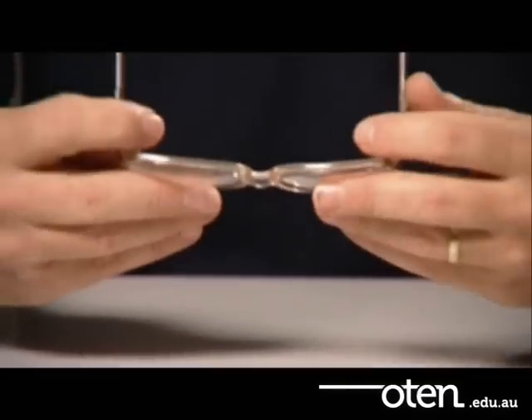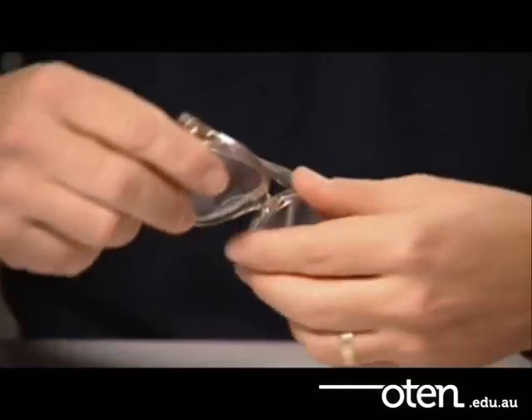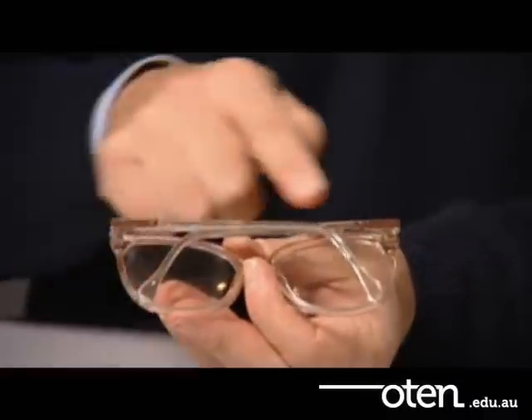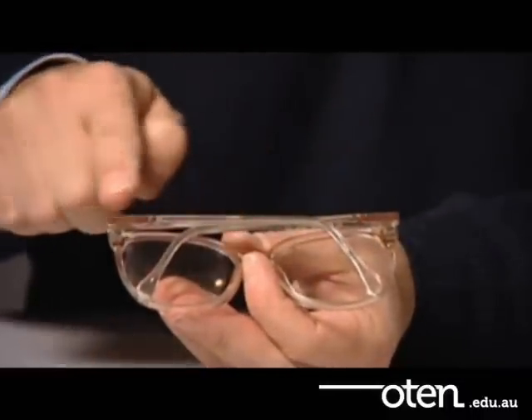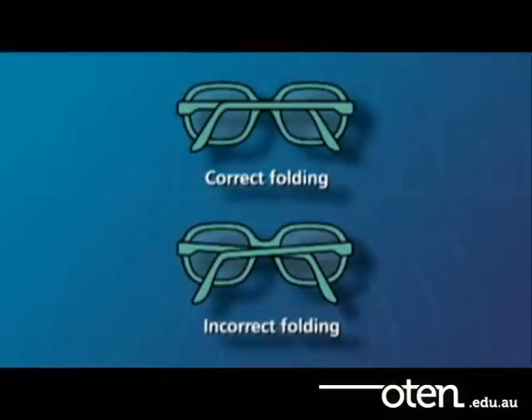When closed, the temples should fold so that they are parallel to one another or form slight angles. These angles should be equal and should cross in the centre of the frame or directly behind the centre of the bridge.